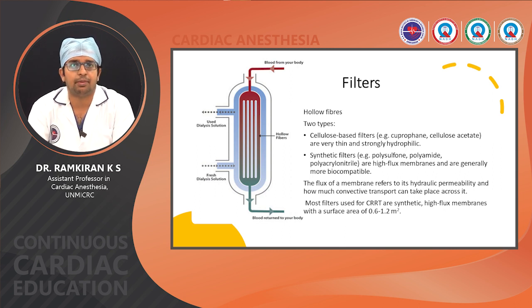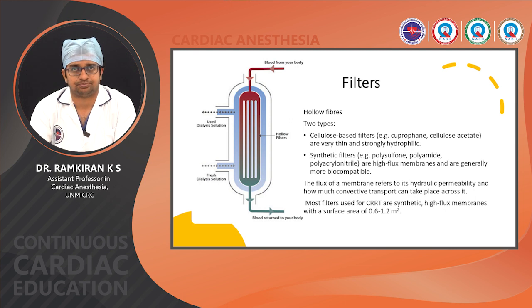The flux of the membrane refers to its hydraulic permeability and how much convective transport can take place across it. So most filters which we are using are made of synthetic, usually high flux membranes with a surface area of 0.6 to 1.2 meter square.